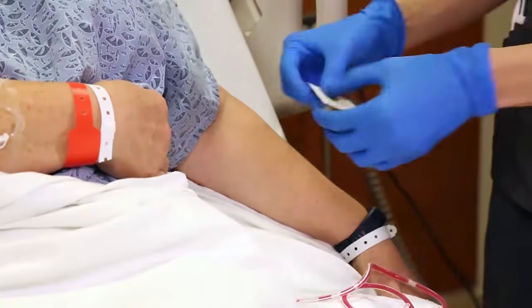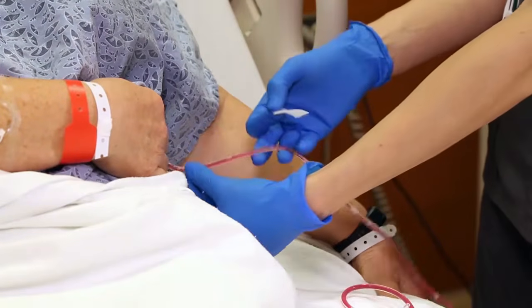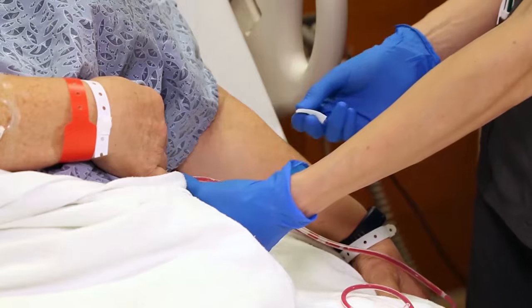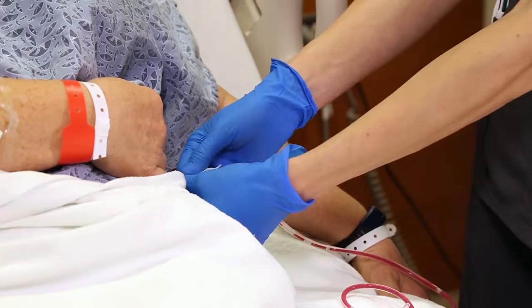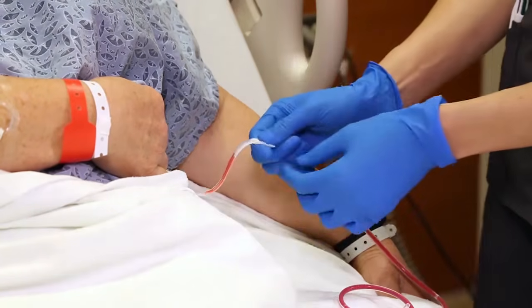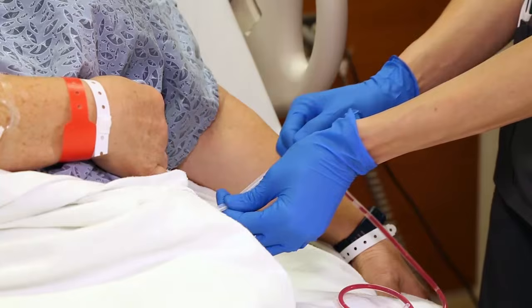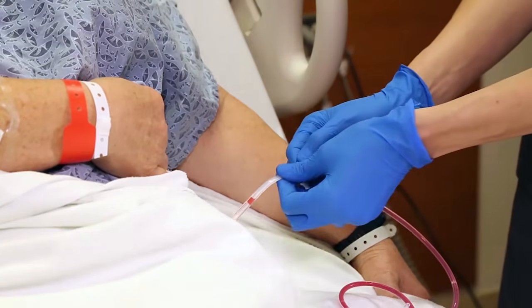You can also use an alcohol pad. Again, hold the tubing close to where it exits the body. Wrap the alcohol pad around the drain tubing. Pinch and pull to strip the tubing. You may see and feel fluid moving back and forth through the tubing, and that's completely normal.